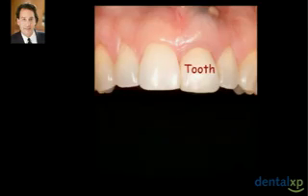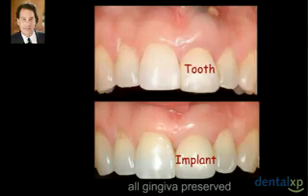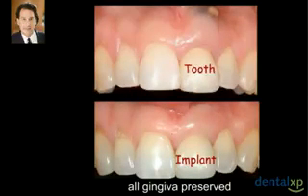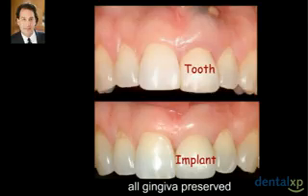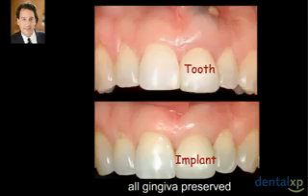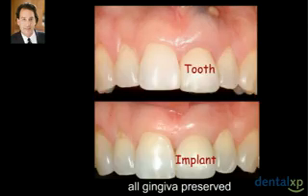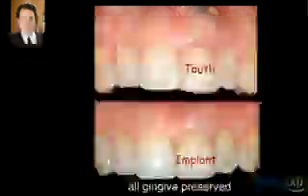Here's the original tooth with the abscess, and here's the implant — no abscess, no difference in soft tissue. A very simple case, an ideal result, because we took our time: extraction, bone graft, three months of healing, implant placement, three months of healing, implant exposure, one month of healing, provisionalization, three more months — eleven months total from start to finish.